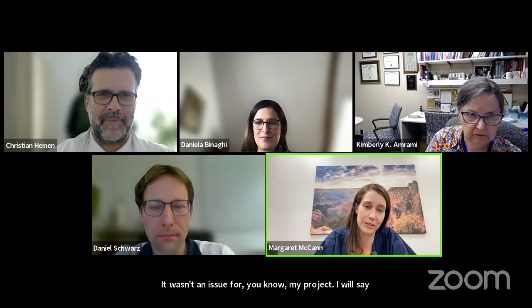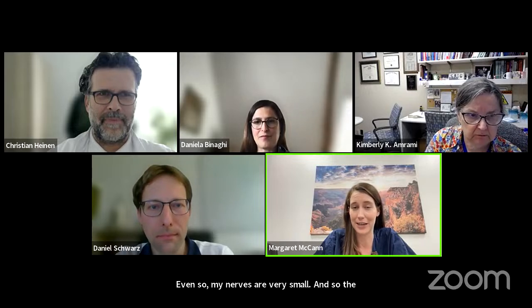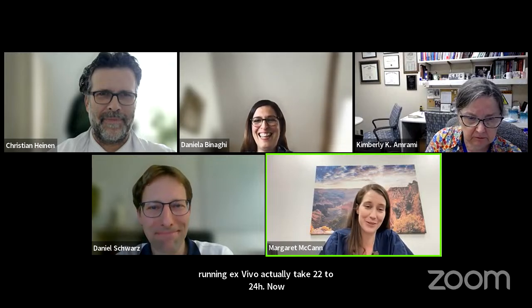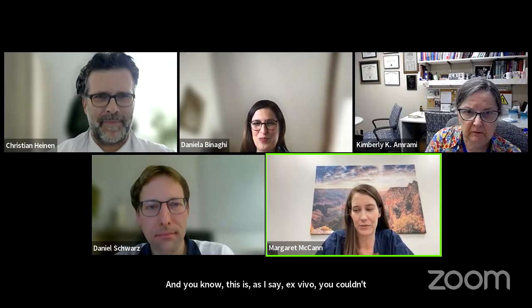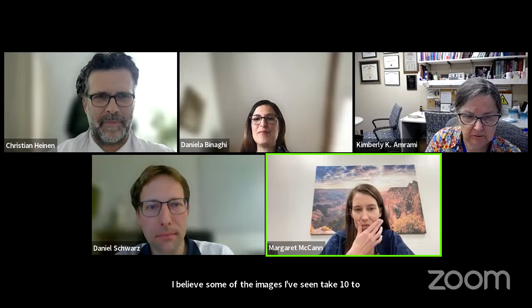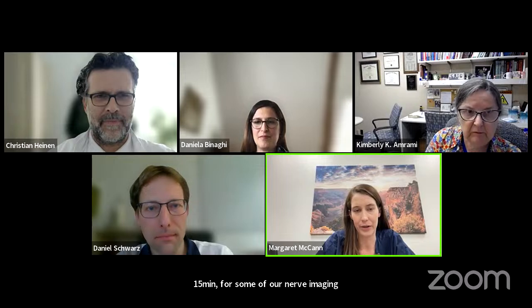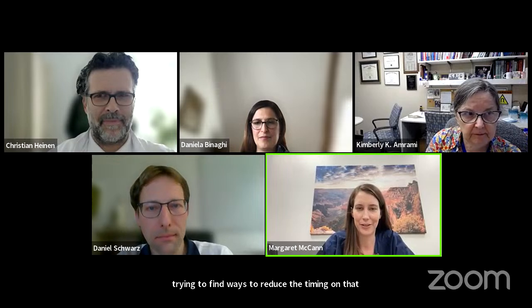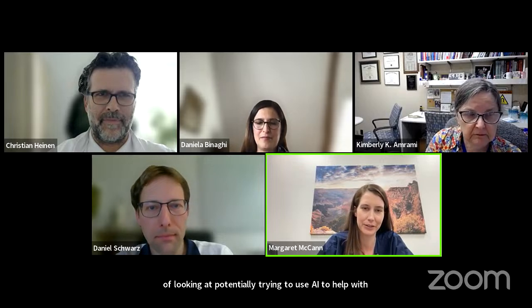I will say the DTI images that I'm running, my nerves, I mean, we were using a 7 Tesla. Even so, my nerves are very small. And so the scans I'm running ex vivo actually take 22 to 24 hours. Now, obviously, you cannot do that in a clinical patient. And this is, as I say, ex vivo. You couldn't do it necessarily even in a rat. I believe some of the images I've seen take 10 to 15 minutes for some of our nerve imaging. And I know that we are constantly working on trying to find ways to reduce the timing on that. And I think people, as you mentioned, are looking at potentially trying to use AI to help with some of that. But I couldn't necessarily speak to where that stands.